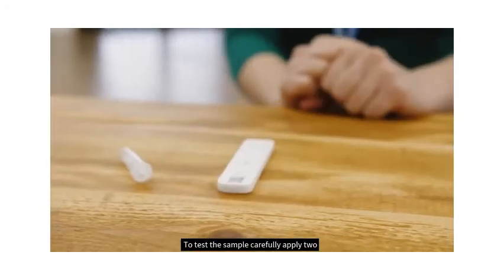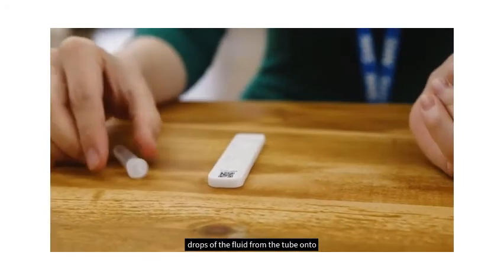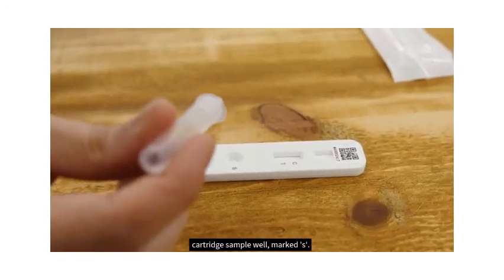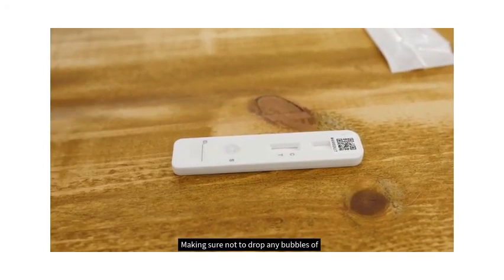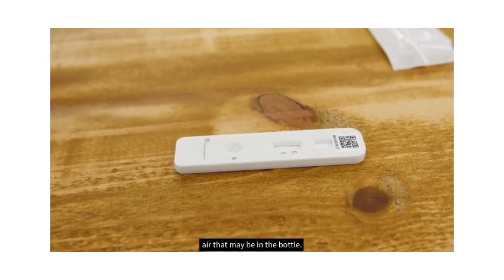To test the sample, carefully apply two drops of the fluid from the tube onto the test cartridge sample well marked S, making sure not to drop any bubbles of air that may be in the bottle.